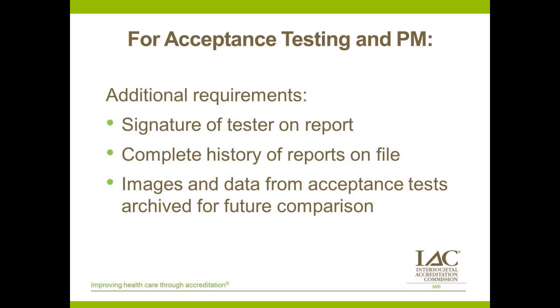So it's very helpful to be able to look at the complete history and say, well, this feature that we're seeing in this particular set of test data, we can look back and say, that was present back at the very beginning when we first installed the scanner, or that has been present for the last 3 or 4 times that we did this. So if nothing else has changed, maybe that's not something we're going to worry about too much right now.